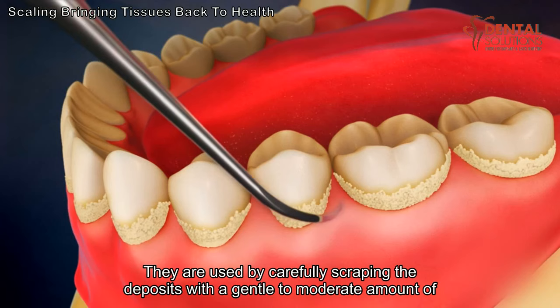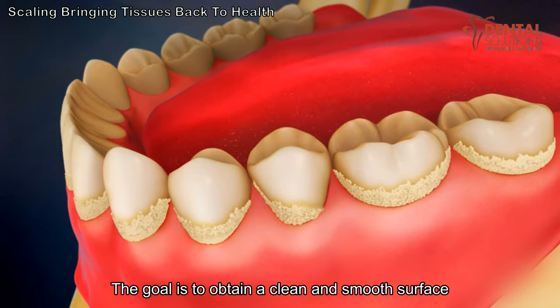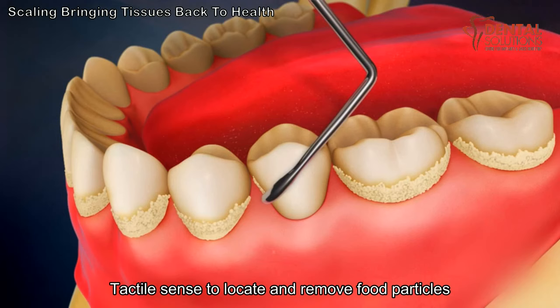The goal is to obtain a clean and smooth surface. By relying on their tactile sense to locate and remove food particles, plaque, and tartar from above and below the gum line, the hygienist can bring the gum tissues back to a state of overall health.